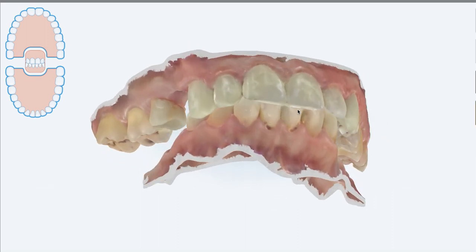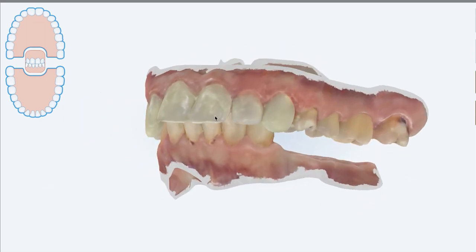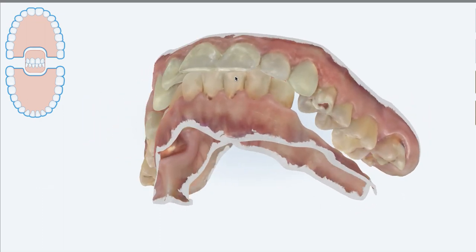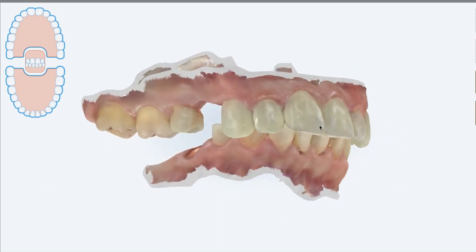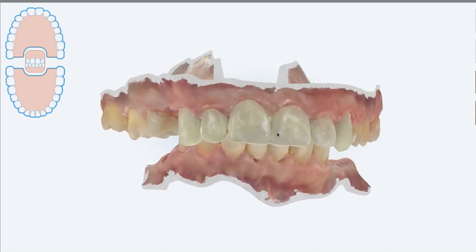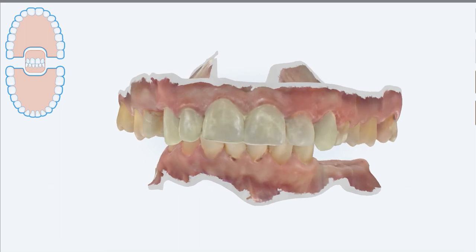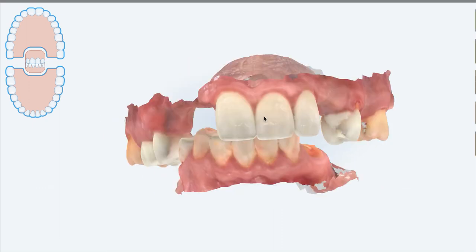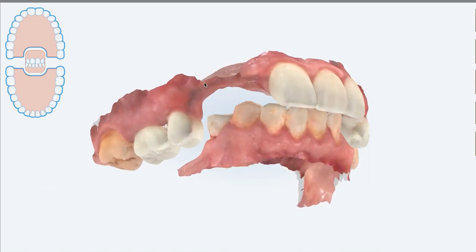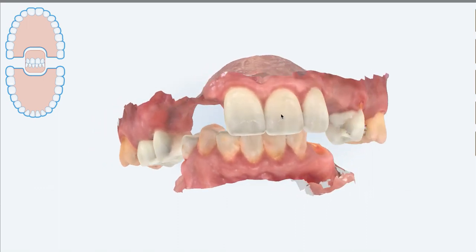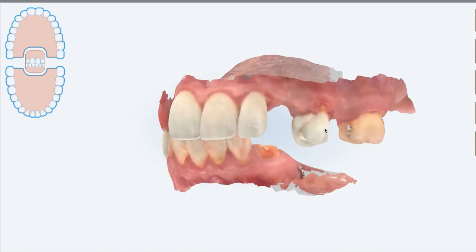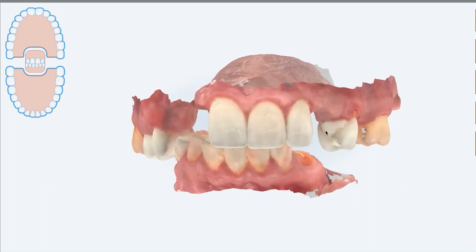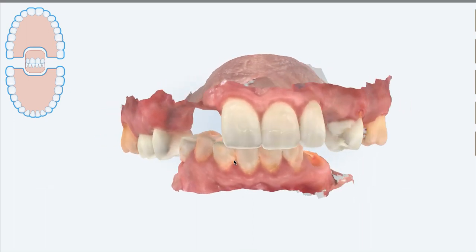Just to show where you started, this patient presented with rather significant decay that this particular Atero scan doesn't necessarily show. But you had started this case three years ago, and here's where you are now. You had removed all the teeth that needed to be removed and crowned at least some of the teeth in the upper arch. Now the patient's ready to start with the lower arch.